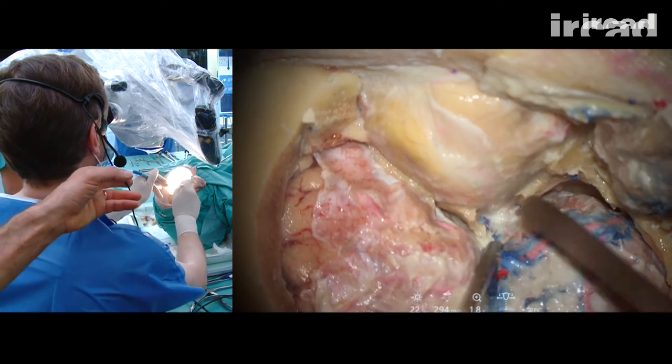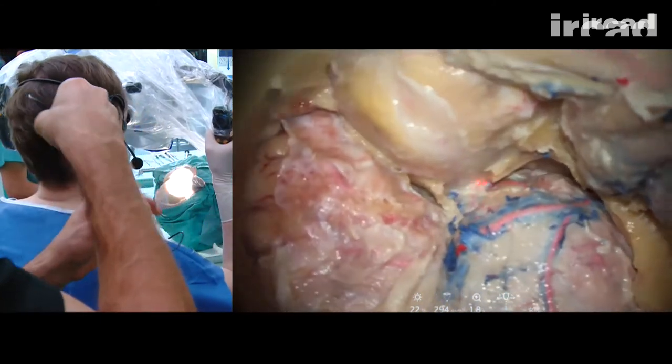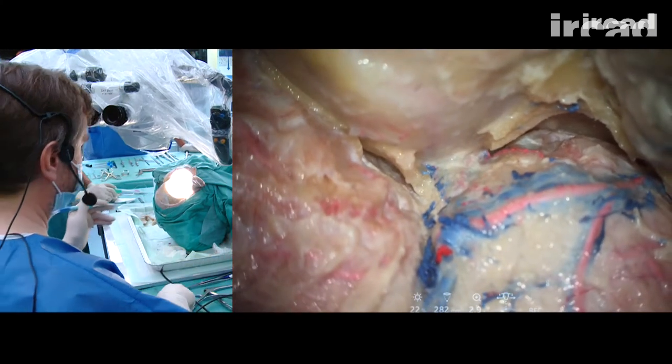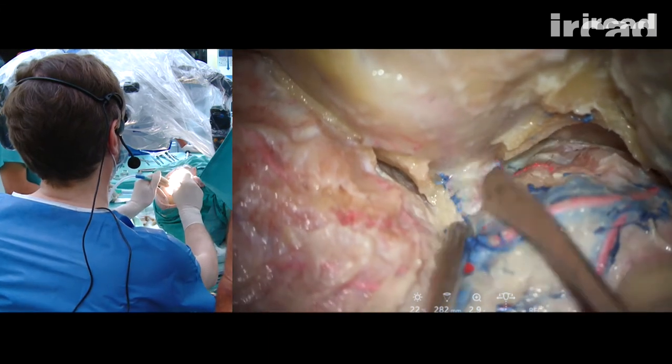And here is the orbitotemporal periosteal fold. Here.